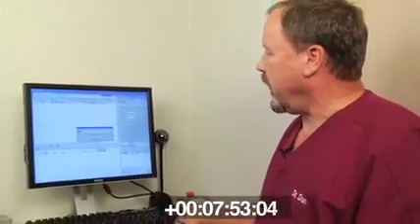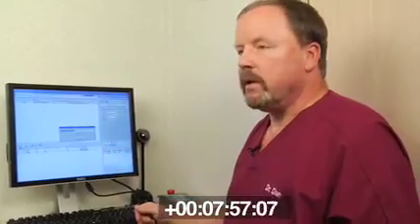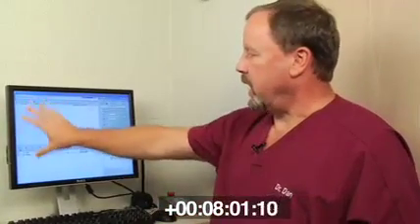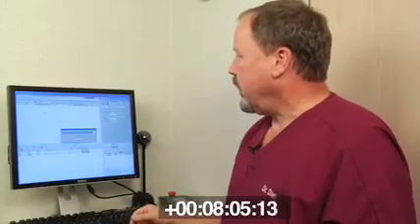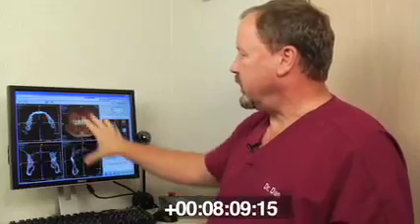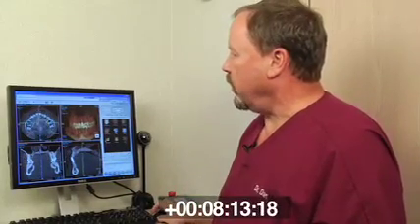It's going to load our data sets here. And in just a couple seconds, it's going to pop up, and we'll see Vince in 3D as well as axials and coronals and sagittal views here. And this is the advantage of having really nice software, because right away these images pop up, and you're able to just go through the image top to bottom.